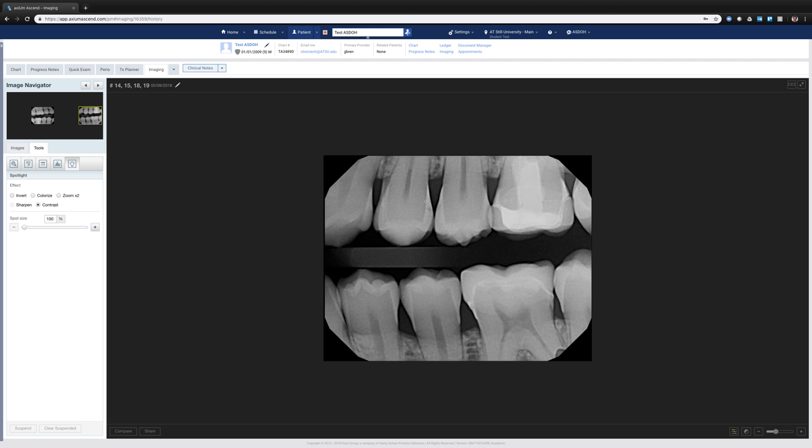So as you're wanting to investigate, maybe I think this is curious, maybe not, I can come in and as I click, because of the spotlight effect I've chosen, I can see with contrast.